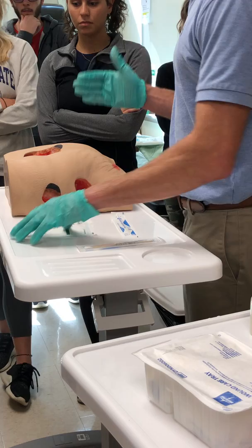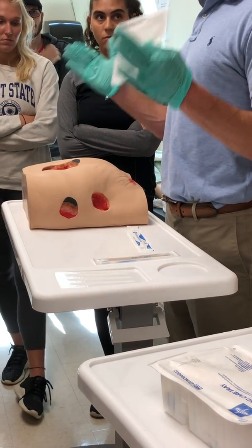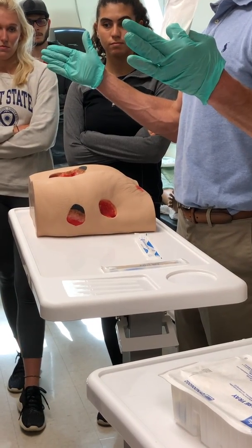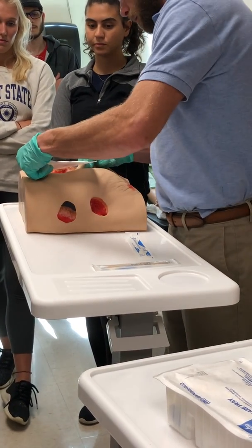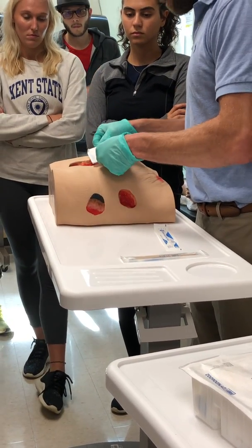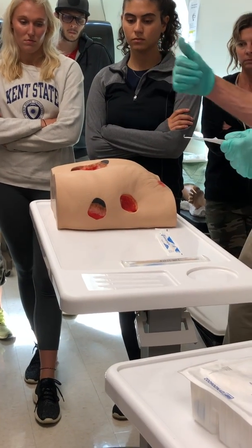So we'll do the width, which is always side to side on the body. It's always lateral. So your width could be bigger than your length. Does that make sense? If you had a long wound this way, it might be wider than it is long. The length is always head to toe, okay? The length of this is 10 centimeters. The width of this is 8 centimeters. So right now I'm 8 by 10.